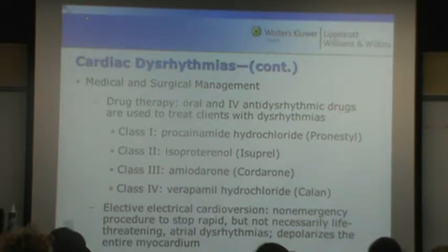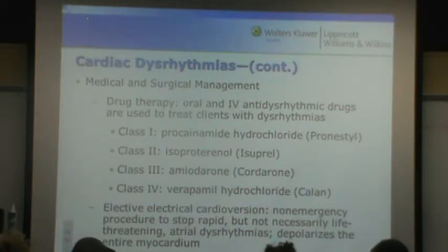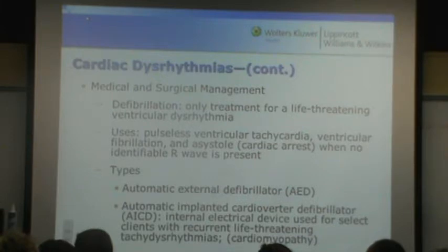Yes, ma'am. So the elective electrical cardioversion, that is synchronized? Yes. If it's elective, then yes. There are different ways to do that, but for the most part in the field, or even for the most part in the hospital setting, we're using the same type of pads that you used with the AEDs. I think even your textbook shows the paddles. Hardly anybody uses paddles anymore. They've gotten completely away from that.